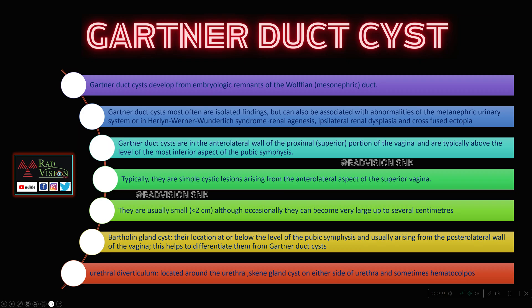We will now look at what is a Gartner duct cyst. Gartner duct cysts develop from embryonic remnants of the Wolffian or mesonephric duct. Gartner ducts often have an association with metanephric abnormalities. Gartner duct cysts are typically located in the upper portion of the vagina and in the anterolateral wall. These are small in size, less than two centimeters, though sometimes they are very large as seen in this case. They may cause compression over the adjacent bladder.